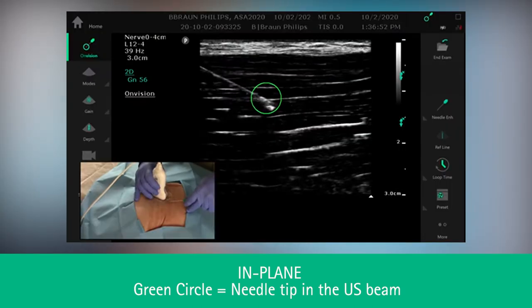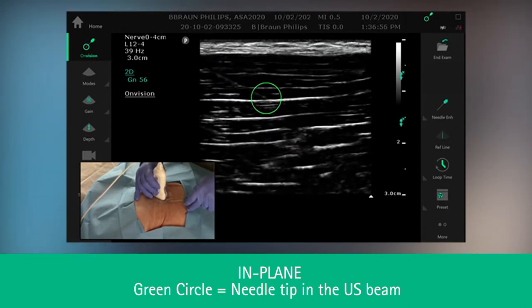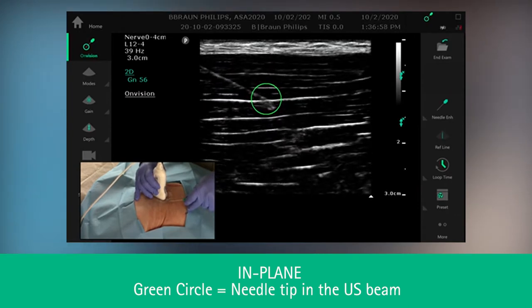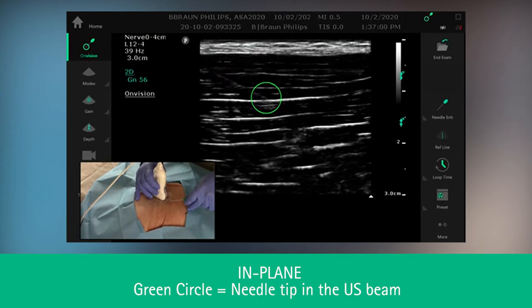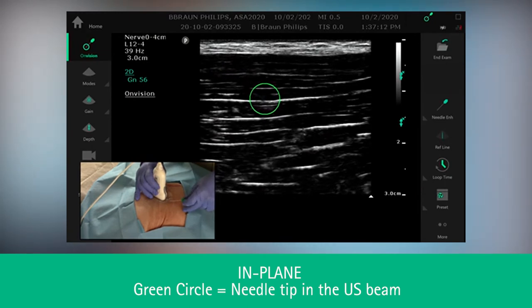This isn't always the case. Under most circumstances, you end up with either partial needle visualization or no needle visualization. What I'd like you to notice is that the needle tip, even without the visualization of the needle shaft, can be identified clearly in the OnVision zone.